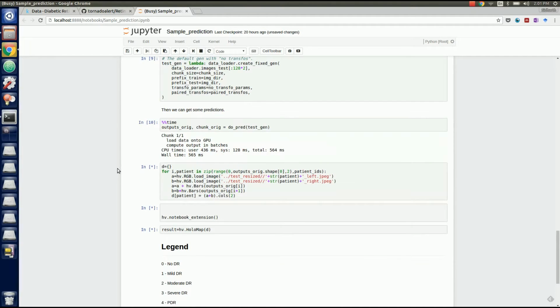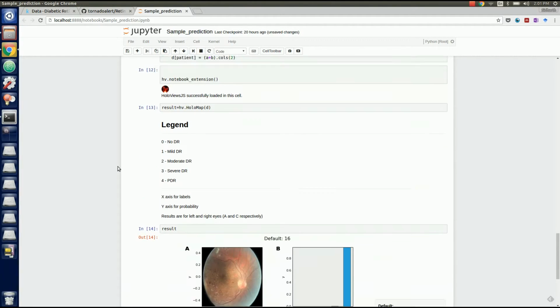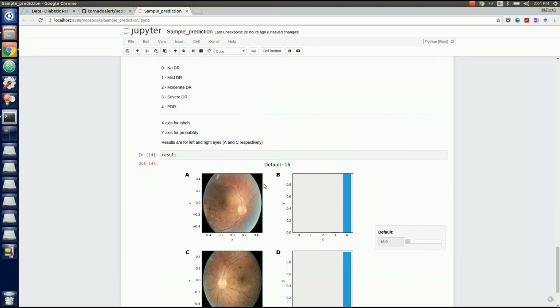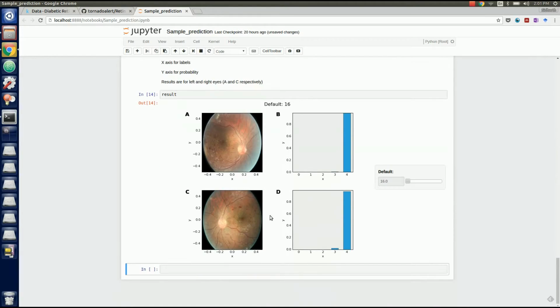Still running. Yeah. So we have our result, and wow, this 4 is proliferative diabetic retinopathy, and it got it right. And you see, this is the probability scale, and this is the classes scale. So 4 being proliferative diabetic retinopathy, and this is almost 100% sure that it's proliferative diabetic retinopathy. So let's see the next one.